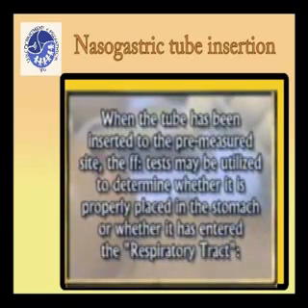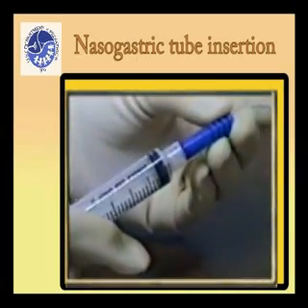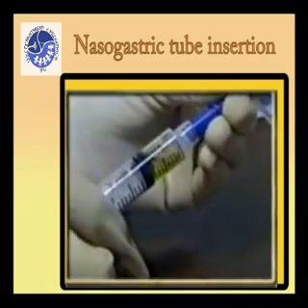When the tube has been inserted to the pre-measured site, the following tests may be utilized to determine whether it is properly placed in the stomach or whether it has entered the respiratory tract. Attach a syringe to the tube and aspirate. If gastric contents are withdrawn, the tube is in the proper position.